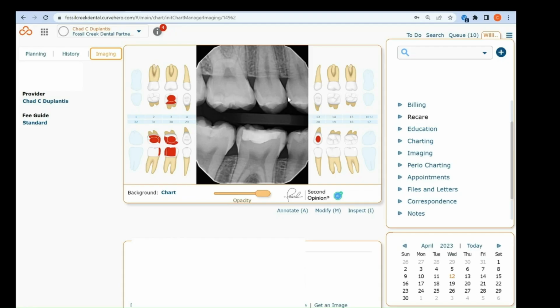So once we took the radiograph, we look at it in our Curve software, and this is the way that it presents to us in our Curve software. And I start talking to mom and the child, and I'm sharing the various lesions that I see, and I'm trying to have a conversation with mom and the child regarding is it something that we treat, i.e., does it go far enough or penetrate the enamel enough to where it's going to be detrimental to the dentin and continue growing?